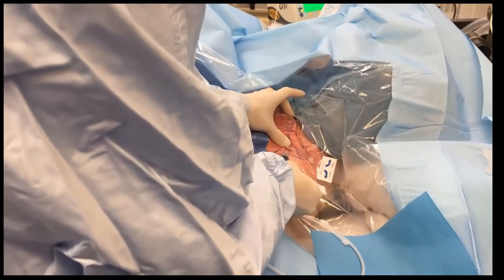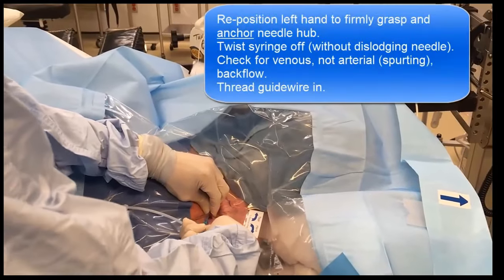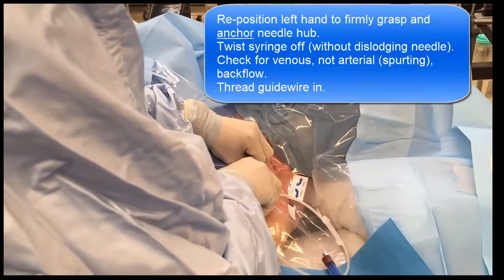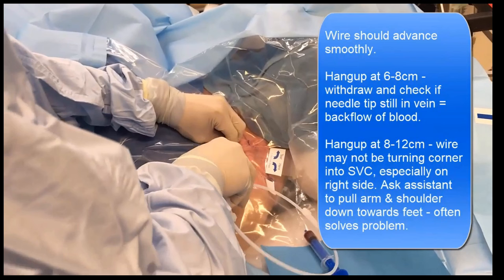A tactile pop and blood backflow will signal vein puncture. Anchor the hub of the needle firmly with your non-dominant hand, disconnect the syringe with a gentle twist, and check that blood is not pulsing back but flowing slowly and steadily. Thread the guide wire into the needle and the vein. There may be resistance to advancement beyond 10 cm, especially on the right side, due to the wire abutting the vein wall where it meets the brachiocephalic vein and superior vena cava — if so, get an assistant to gently tug the arm and shoulder downwards. Listen for PVCs as the wire is inserted; these confirm the guide wire has entered the right ventricle. The wire may sometimes turn upwards into the internal jugular or cross to the contralateral subclavian vein, but these are fortunately rare occurrences.